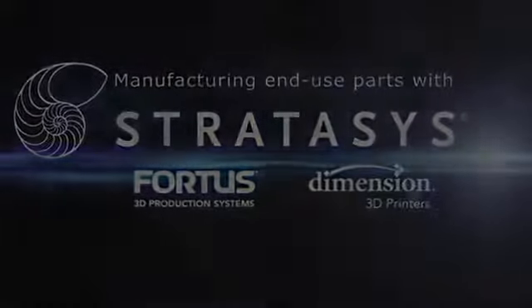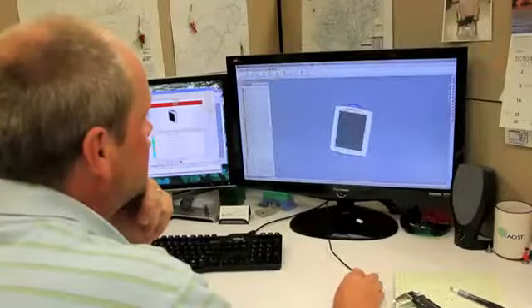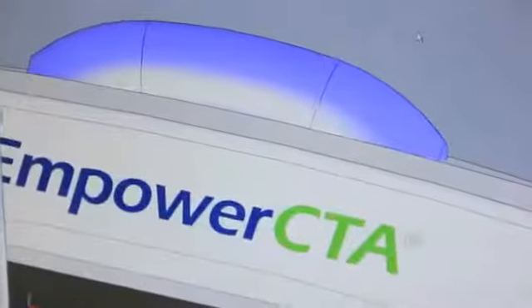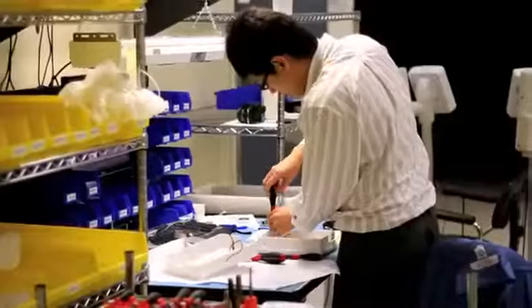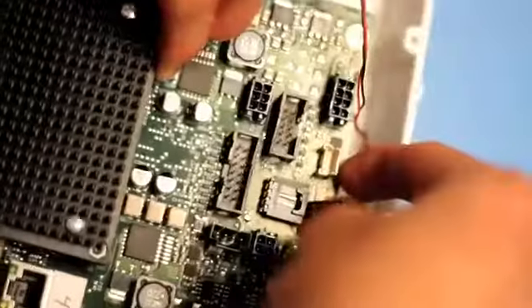The CTA is a lower pressure injector. We're going through a product update, but we're really looking at producing maybe the first production run using the FDM process. It makes a great substrate for the process and for the parts. It also allows us to really do some design for manufacturing and eliminate a lot of pieces.